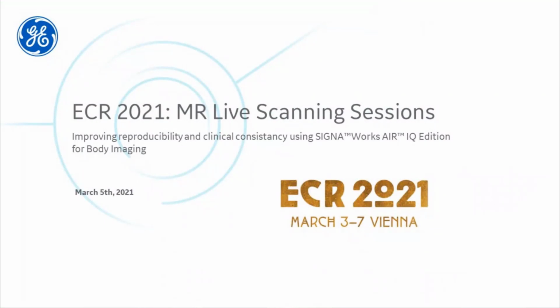Thank you, Jeremy. And this is Friday. We are halfway through the ECR live scanning session. Let me share with you the rest of the agenda of those live scanning sessions in the chat. As Jeremy mentioned, we'll be having tomorrow morning, 10 a.m. Paris time, MSK imaging session using the air multi-purpose coil. So this is the second air coil that Jeremy has shown to you. And finally, we'll close the ECR live scanning session on Sunday with cardiac imaging at 3T using as well the air coil technology.